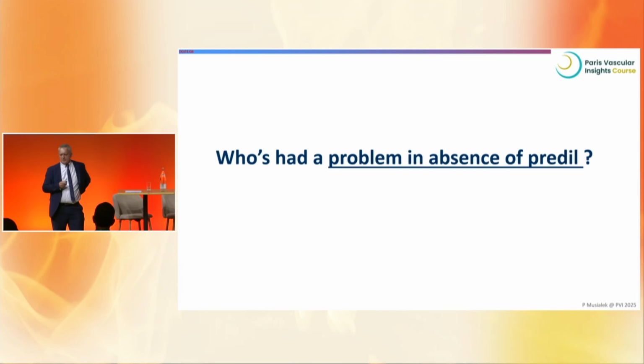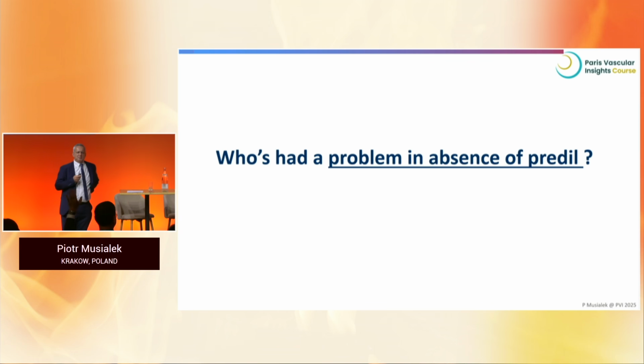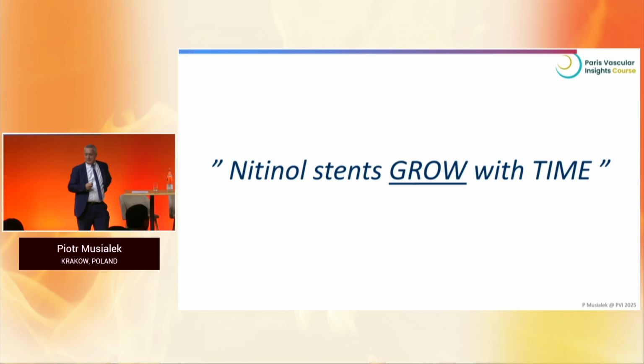So we've discussed when to predilate. So who's had a problem in absence of predilation? Relatively few people predilate. Anyone who's not predilated and then they regret it, they should have predilated? 1, 2. Professor Schneider is very careful with his choice of techniques. Happened to me too. I used to stent directly more.